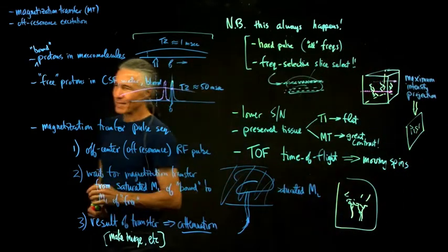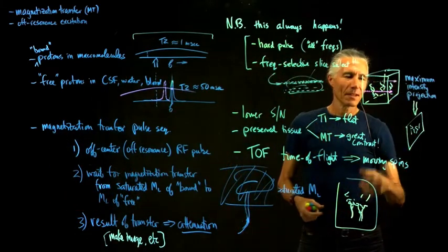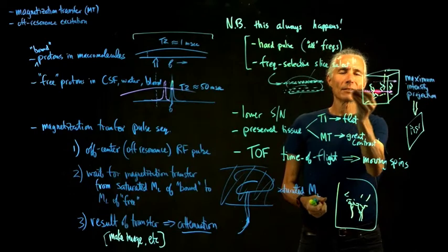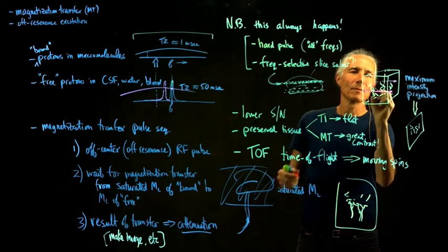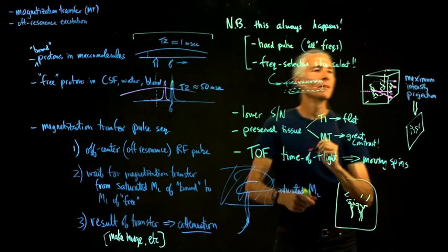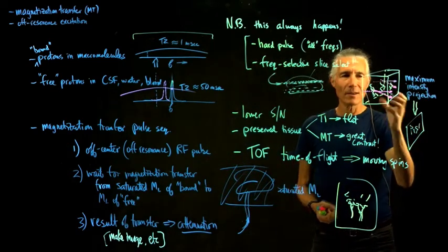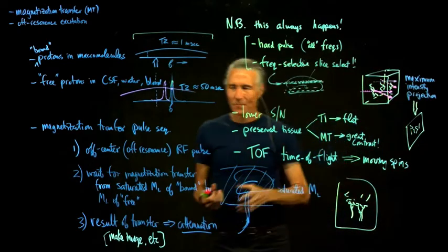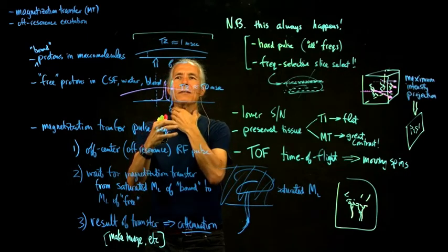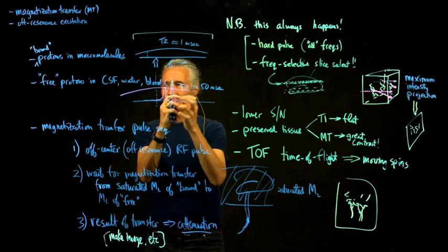But that's not animated. So how do you animate it? Well, just rotate your lines a little bit, and do the same thing. So instead of running the line straight through this way, run them slightly out at you like this way. Do exactly the same thing. Calculate another 2D image, and if you rotate slowly, what you'll get is something that looks like you injected contrast into all the carotids coming up, and you can see the blood vessels rotating around, and you can look for problems there.